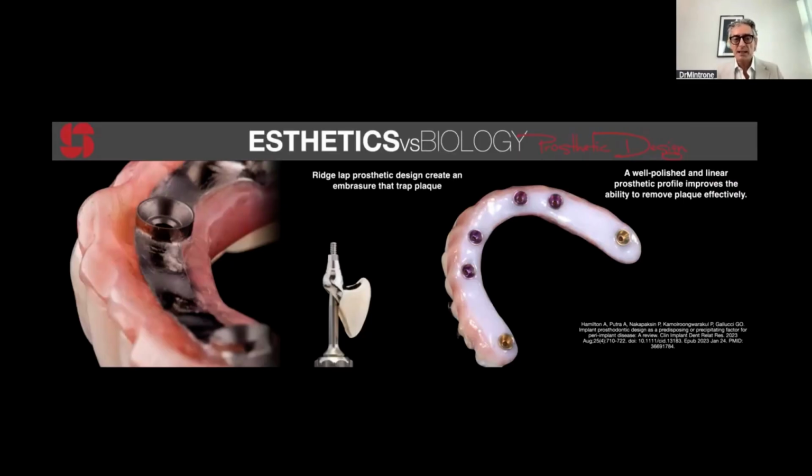Or cases like this, where we place an implant, we take an impression, we ask for a nice and beautiful restoration, and then the technician creates something strange. But who is to blame, the clinician or the technician? Also in this case, if we want to obtain something really nice, of course, we need to give the technician the opportunity to create something ideal.